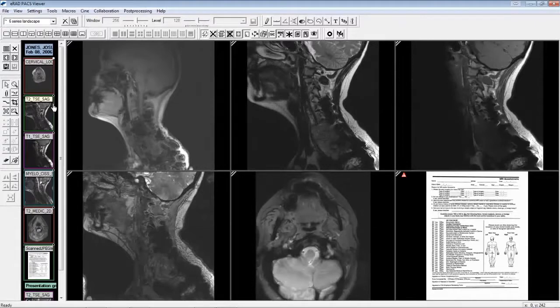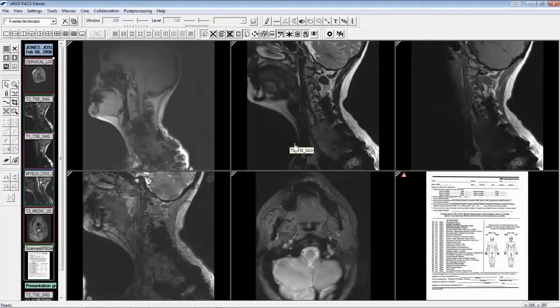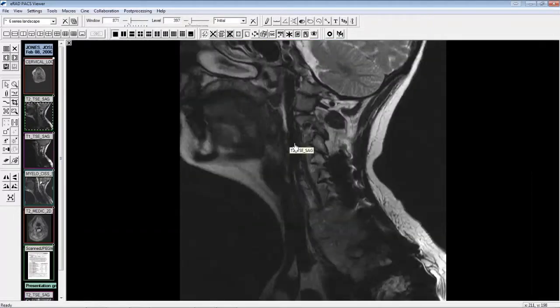The next viewer behavior change has to do with double-clicking an image. Previously, double-clicking on an image or image frame did absolutely nothing. Now, when double-clicking, you will notice the layout changes to a 1x1 format. Double-clicking again will revert to the previous layout.